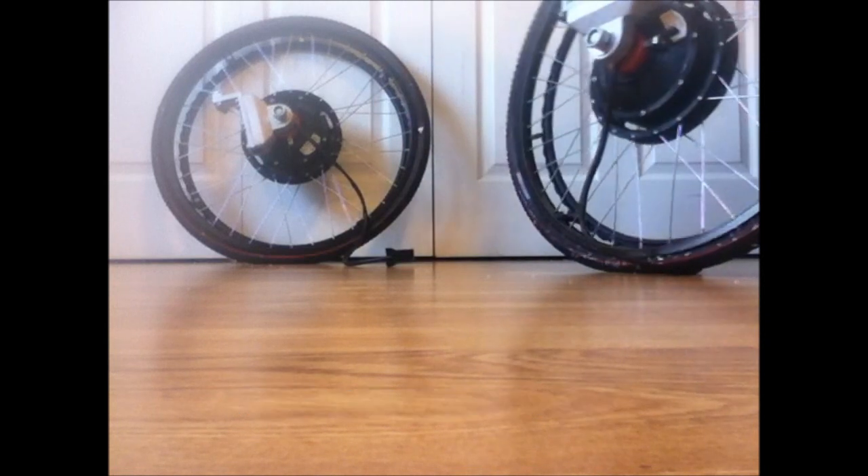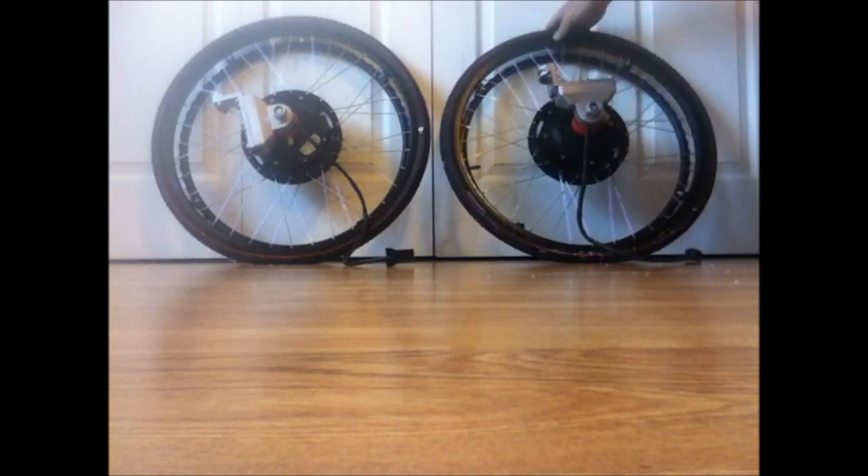These wheels were actually used in a wheelchair in a movie from Morgan Freeman. I was actually quite impressed with the fact that they used our product.